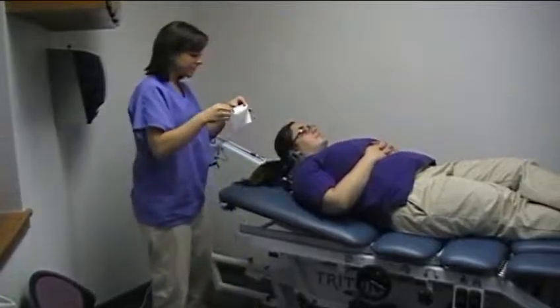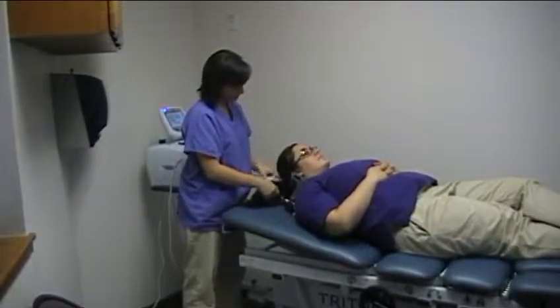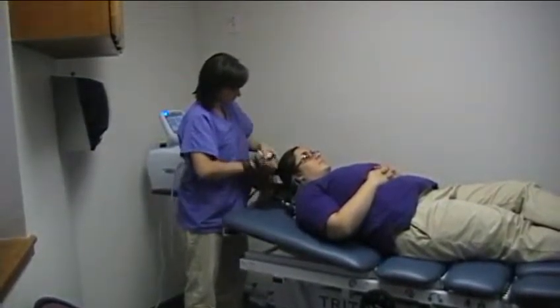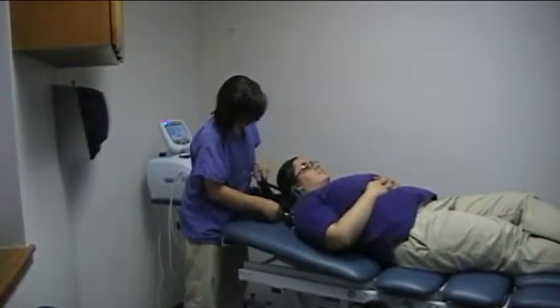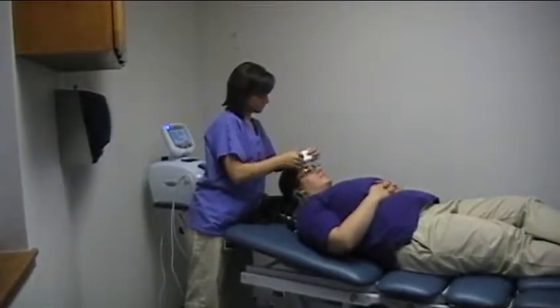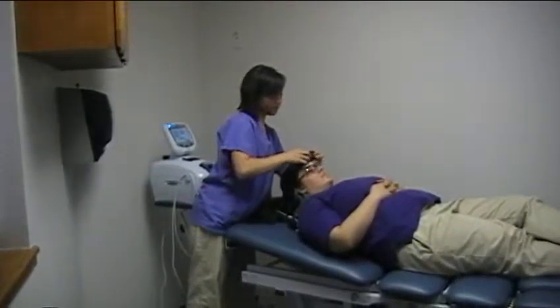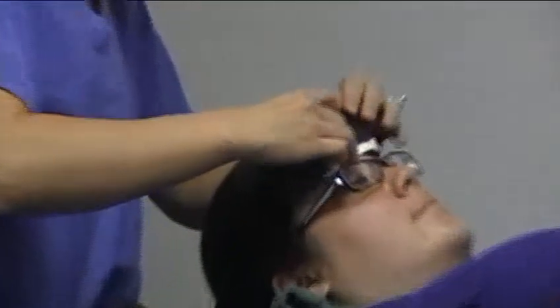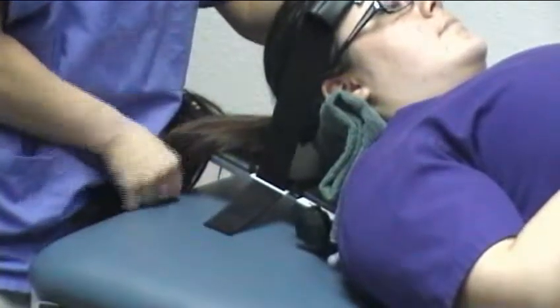You want to have a Kleenex on hand so you can put it on the forehead of the patient before the head harness goes on. The head harness will rest right on the forehead, right above the eyebrows. You want it tight enough so it isn't uncomfortable, but enough so they aren't going to move.